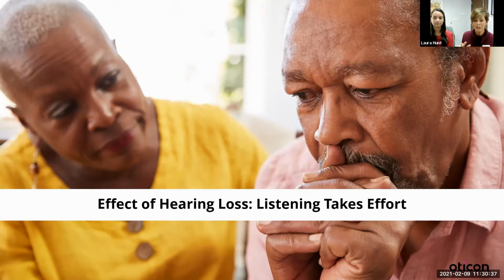a normal conversational environment, but when you get in somewhere you're going to go shopping, you can put the mask program on for that time, because we do know that the masks and the effort to hear and comprehend are much higher. It's so much higher. And prayerfully, we're going to get out of this pretty soon.